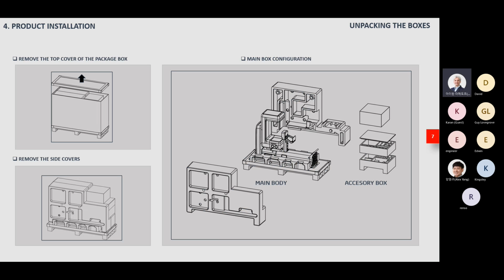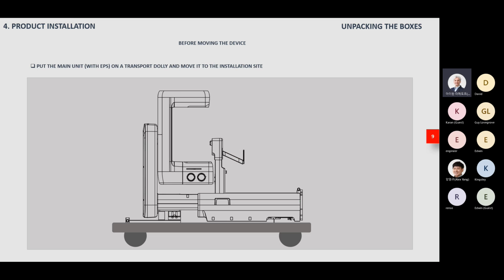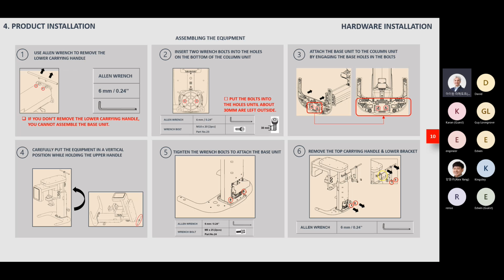How to open the box and get the device outside is quite easy for those with experience. So I will skip most of this, just for your general reference. You can do it later. But don't forget, you have to use this dolly to move the device from one point to another, because even though it's lighter than other 3D devices, it's still quite an expensive and heavy device. So using a dolly would be advisable.